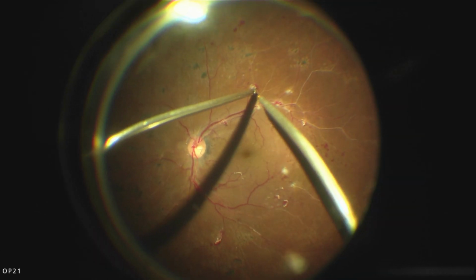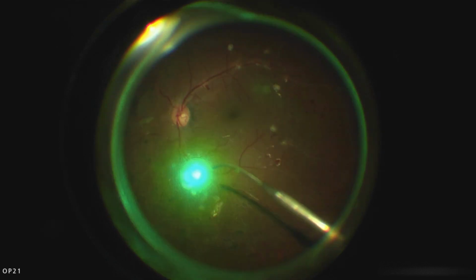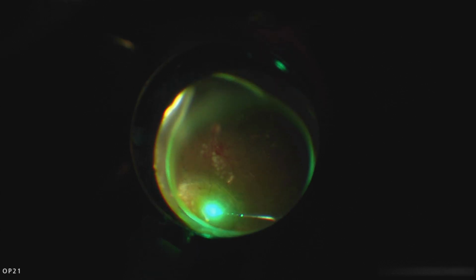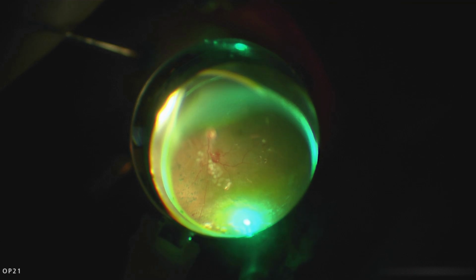So, final check: stop some of those bleeding hemorrhages and apply proper laser, especially in areas where one has done diathermy. And in these cases, which tend to bleed a lot, I do end the case in air. That's the end of the case.